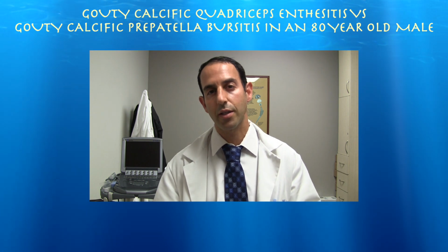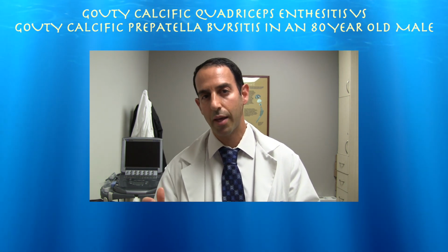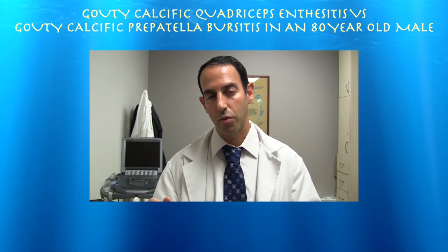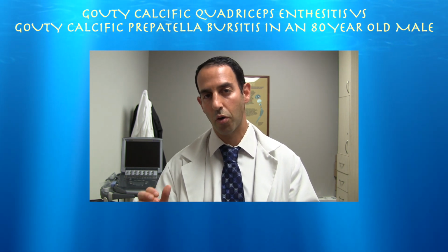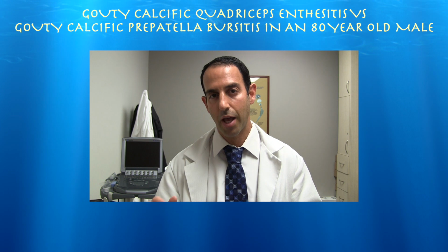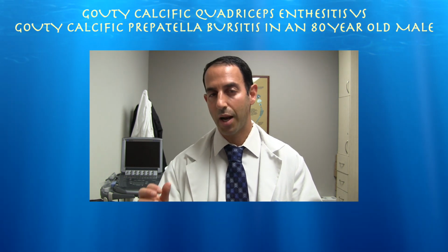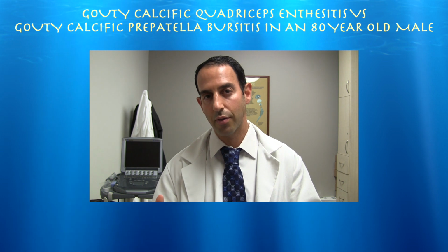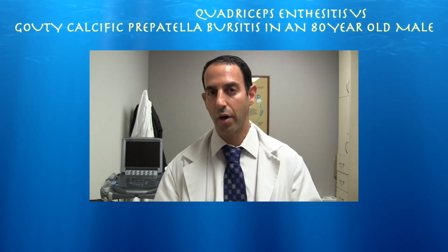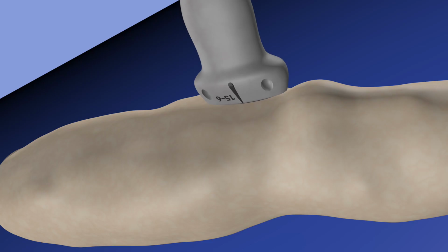Here's a very interesting case of a man that just had a couple days of extreme pain in his knee. There was no injury, and basically on physical exam he had a lot of tenderness at the insertion of the quad tendon. Ultrasound did demonstrate some calcification of the distal quad tendon, and I believe he was suffering from a gouty enthesitis of the quad tendon. In the past, I treated this patient for a gouty olecranon bursitis.